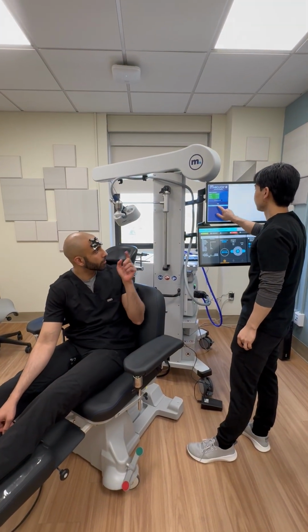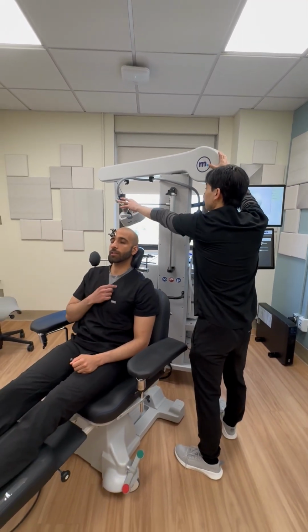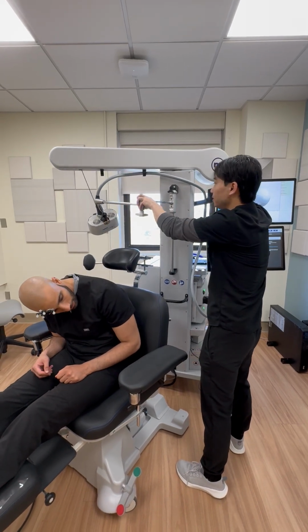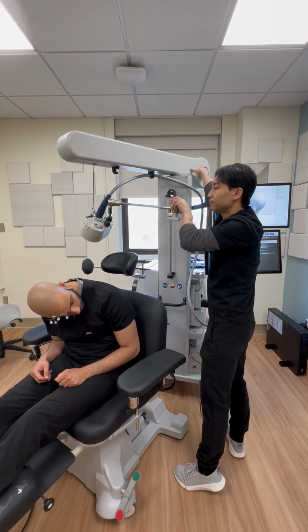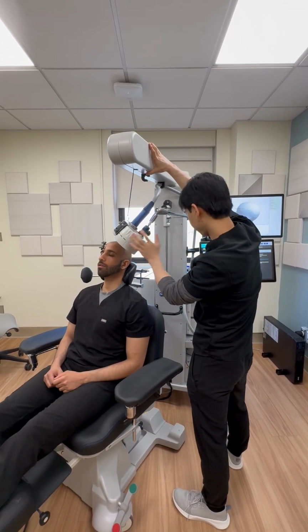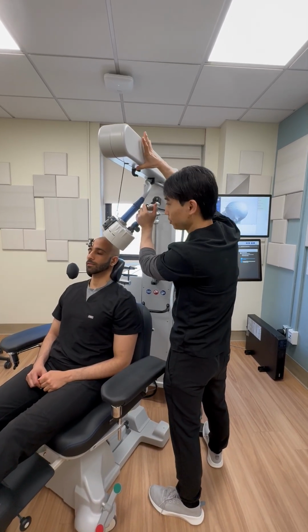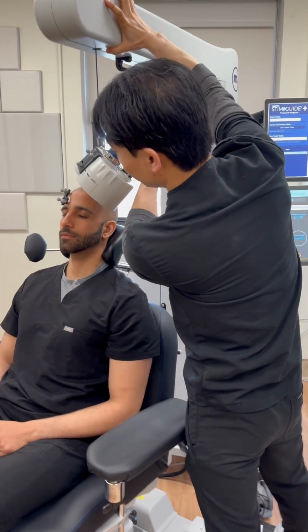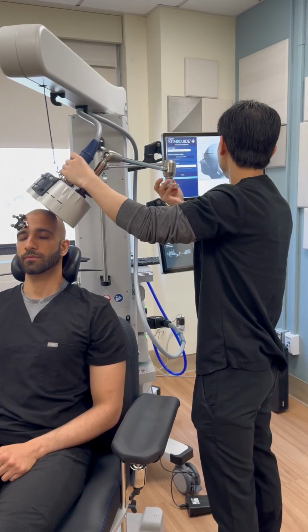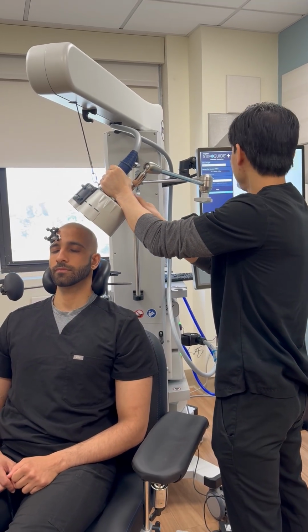We're going to navigate to the treatment target. And now we have the treatment target up on the UI screen right there. All right, so we're going to put the treatment coil on the treatment target. We're generally going to swing this so it's right above the patient's head. We're going to loosen the knobs so we have full range of motion.